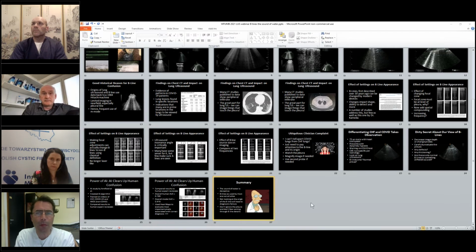This is a bit normal, as there is no validation, but actually it makes it difficult to compare the evolution of a patient if this patient is assessed in different wards. Yeah, in my facility, there's no consistency. The wards and the ICU use different scoring systems. There's poor documentation of them, so it frequently causes confusion, which usually leads to increased radiation exposure for the patient, more X-rays, more CTs.